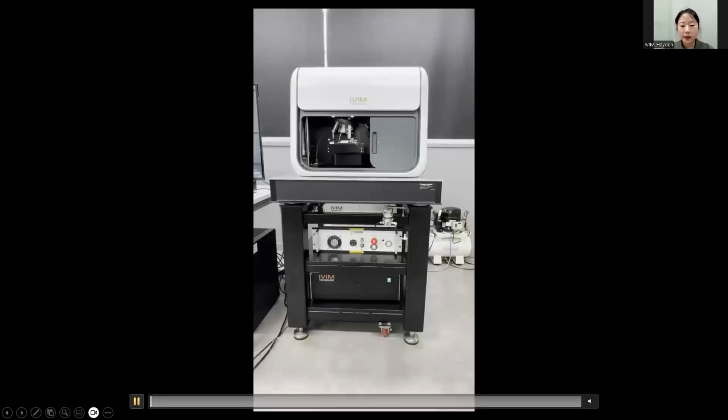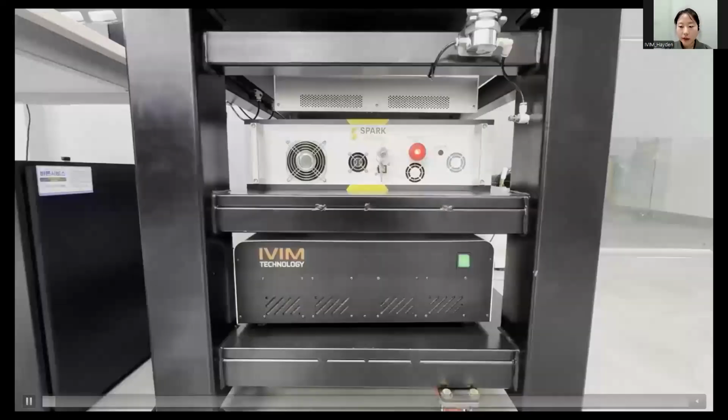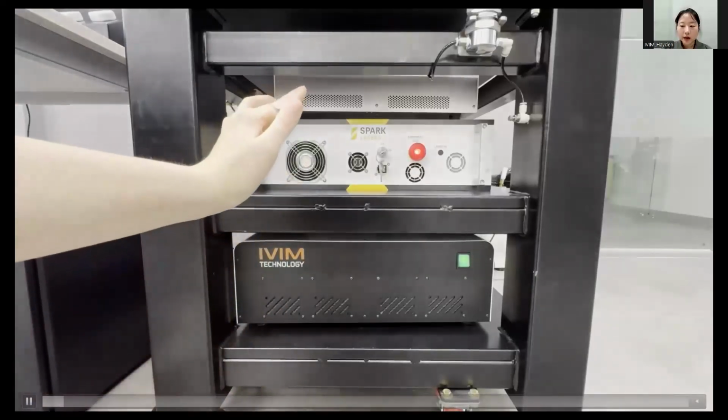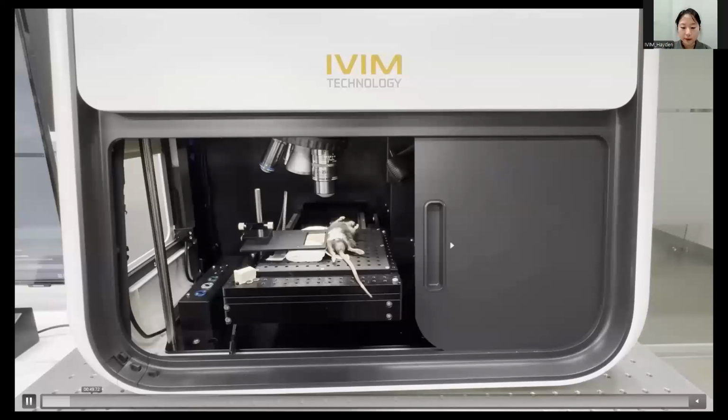So I started the video. I will explain the real procedure of the imaging process. At the top, you can see the main body of the microscope, and at the bottom, there are various supplies. We'll notice three main devices: the main power supply for the microscope, and the power supplies and controllers for the two photon and the confocal laser.